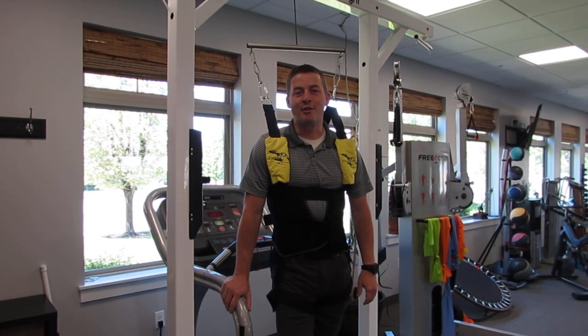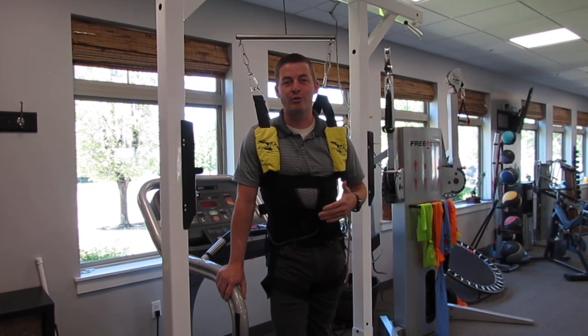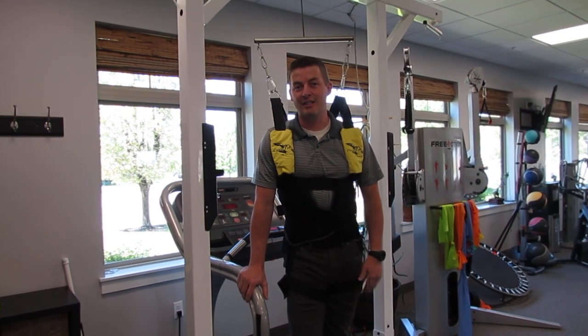Hi, I'm Dave with Align Therapy. I wanted to talk about a couple of options that we have for unloading the joints of the body — whether that's unloading the back, the knees, the ankles, or anything like that.